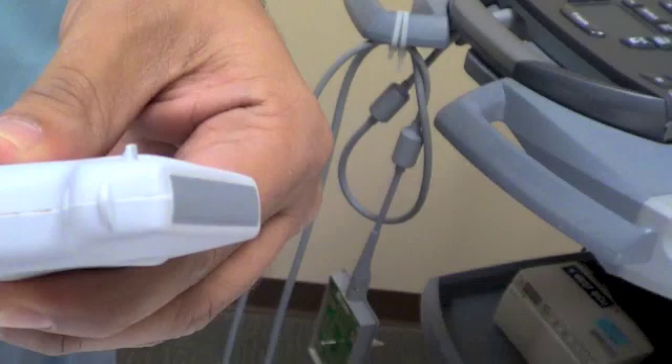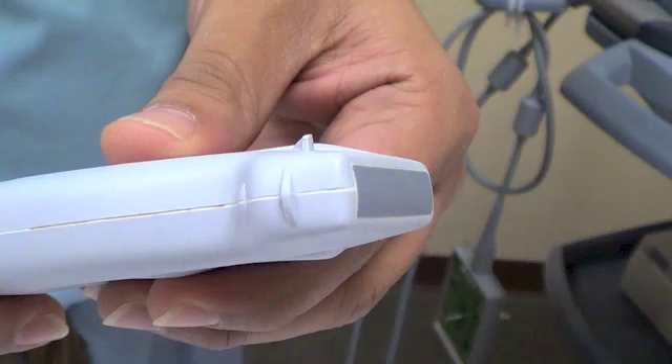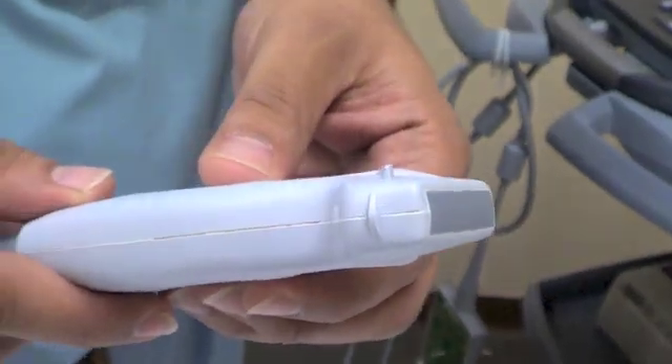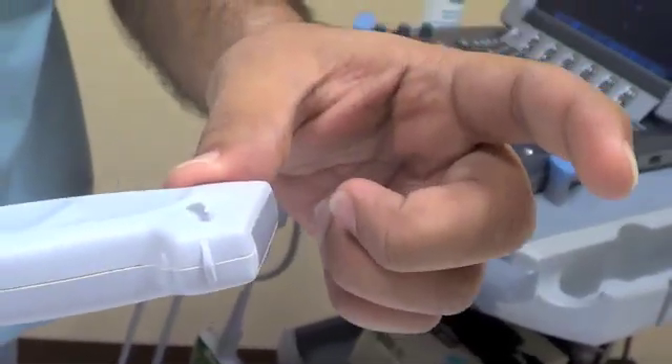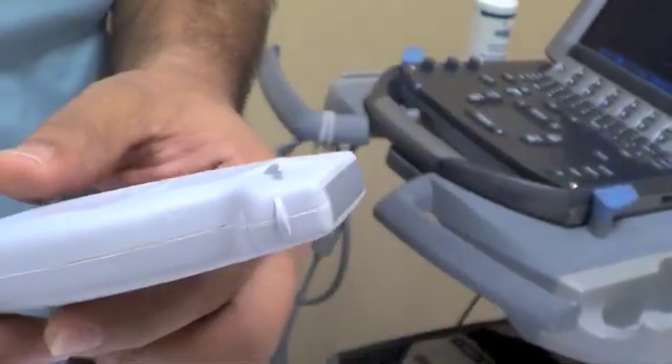There's a marker here called the probe marker, and it corresponds on the machine to usually a blue dot or a symbol for the company. Because it only transmits to a shallow depth, it has higher resolution, so you can see things a lot more clearly.